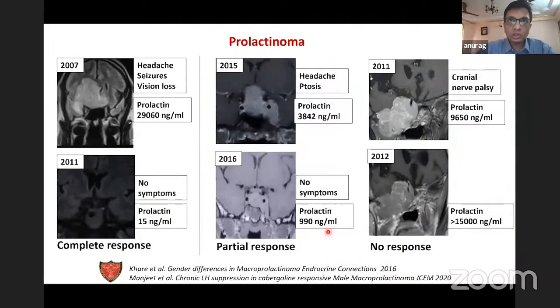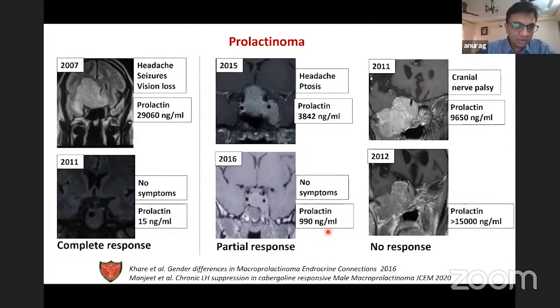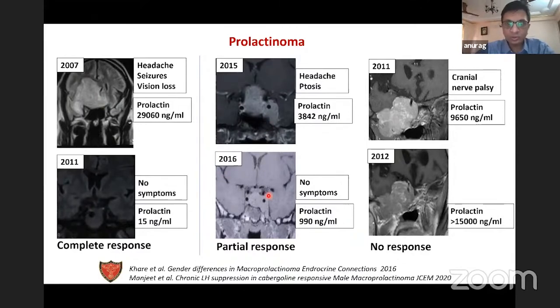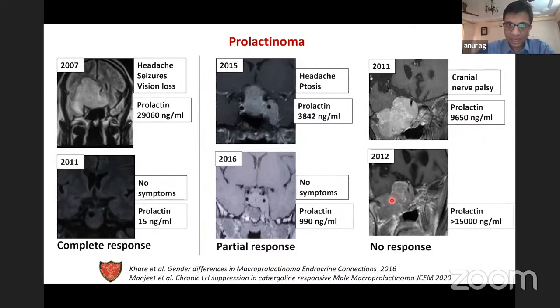Response to cabergoline — the primary treatment modality — is defined by MRI as volume reduction of 50% or dimension reduction of 30%. Large prolactinoma tumors can melt away completely with cabergoline. There may be partial response or discordant response, and there are resistant cases where the tumor keeps growing, including aggressive tumors.